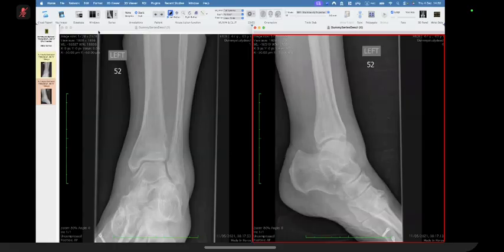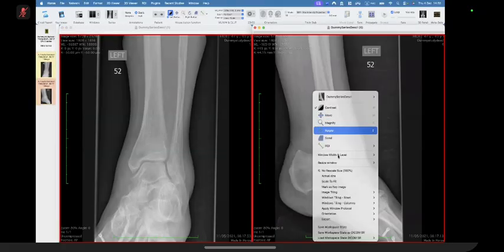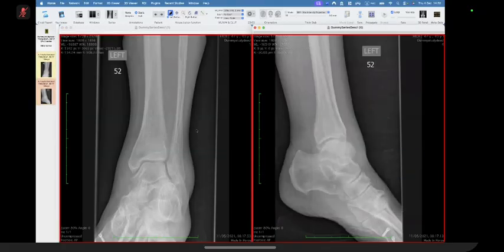She's been referred by the orthopedic team for an injection into her ankle because she is in pain. She's come in with her daughter and she's in a lot of pain. You are about to do an ultrasound guided injection in her ankle. What do you think?